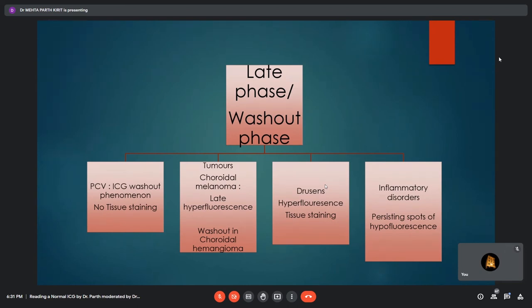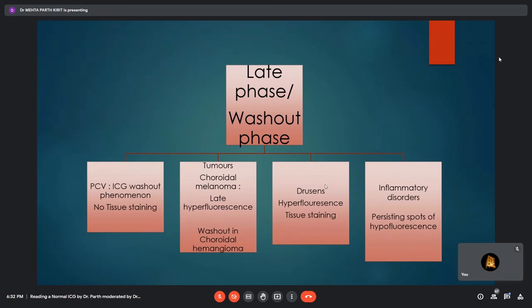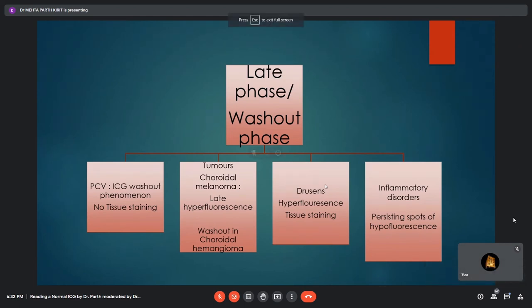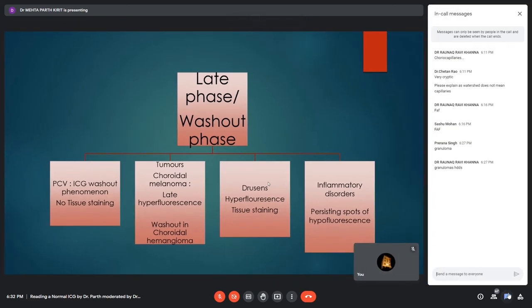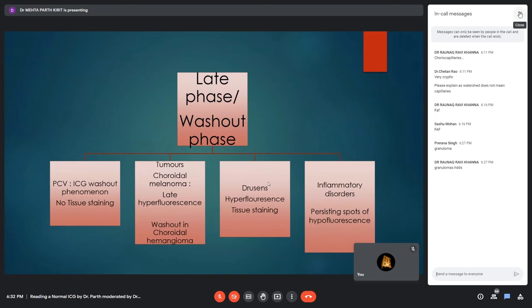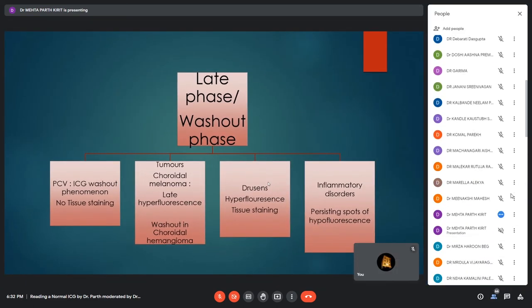The moderator asks why persistent spots of hypofluorescence occur in inflammatory disorders. These are believed to represent choroidal granulomas, or in some views, flow deficits or areas of ischemia. A consultant adds that choroidal granulomas are very well delineated by ICGA in VKH, making ICG very good for detecting choroidal granulomas and aiding diagnosis.